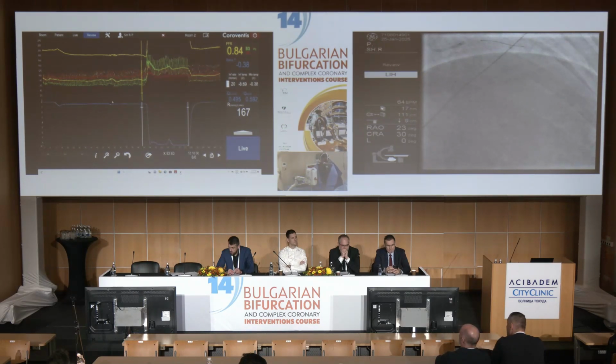You see how all these things go hand in hand, and you see how precise and accurate all these changes are. So we are no longer speaking of vague measurements, proxies. No, these are milliliter per minute. I will stop here. Thank you very, very much. Congratulations for your first absolute flow measurements.